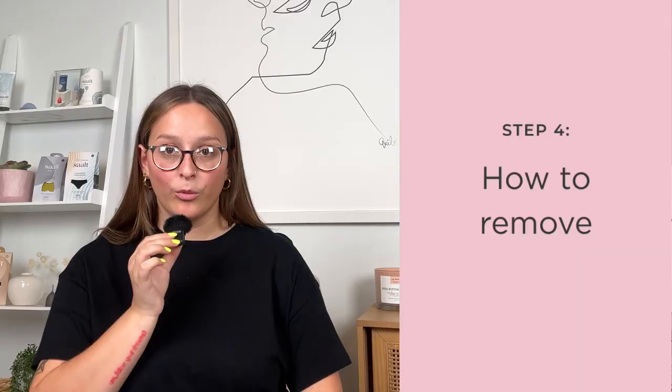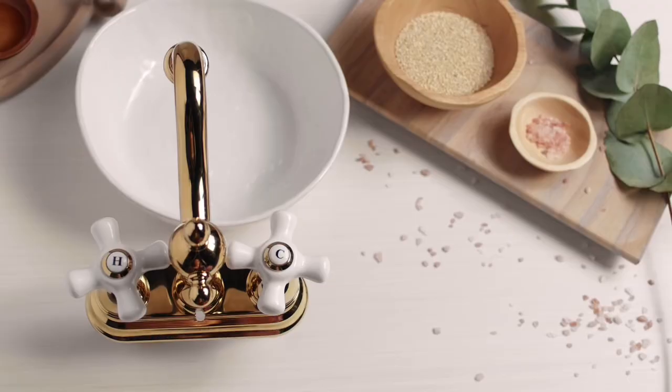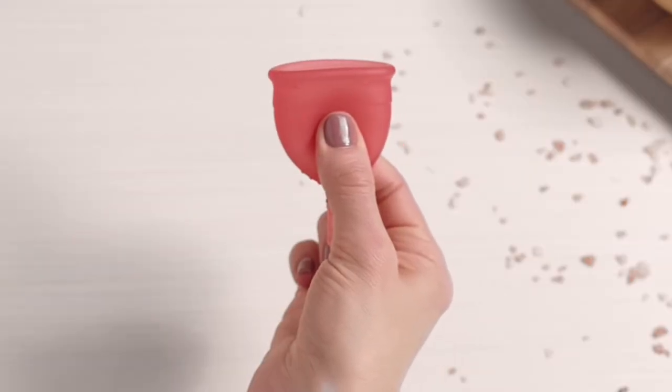Now, we're going to go over how to remove your cup. Just like when you're inserting it, wash your hands first. You can do it over the toilet or in the shower. Gently bear down with your pelvic floor muscles, like you're going to the bathroom. This will push the cup a little bit lower. To break the seal, gently pinch the base of your cup. This will release the suction seal. Do not pull on the stem. Keep the cup upright as you guide it out to avoid spills, and empty the contents into the toilet or into the shower.